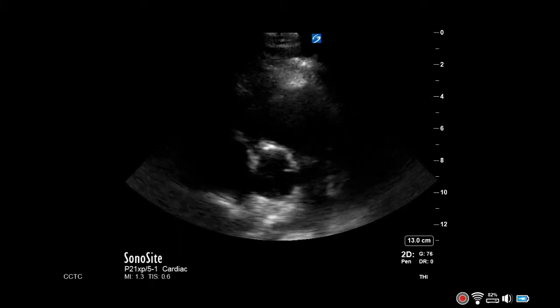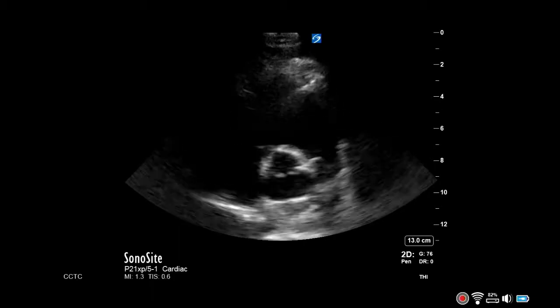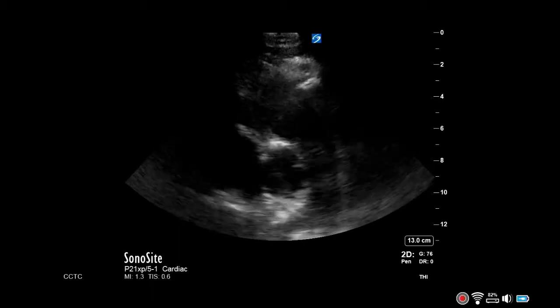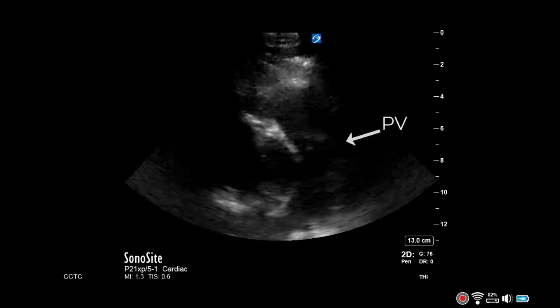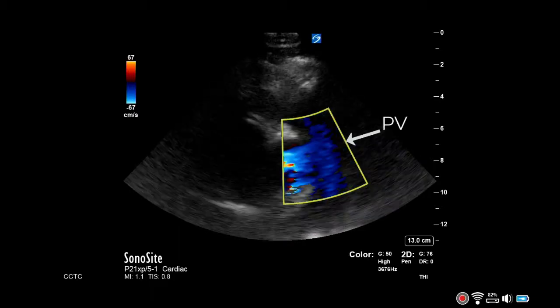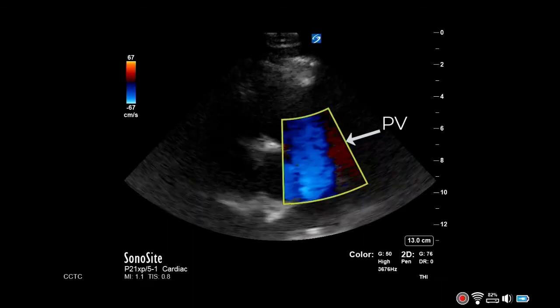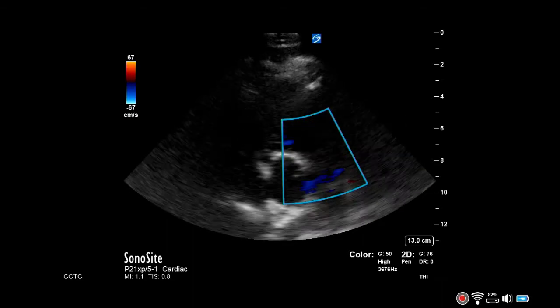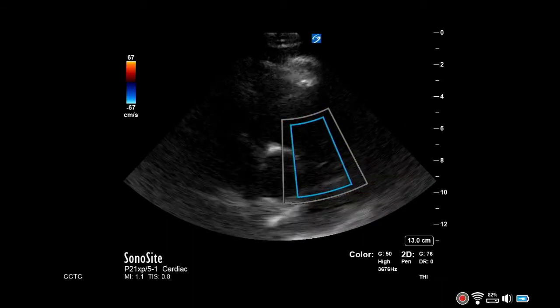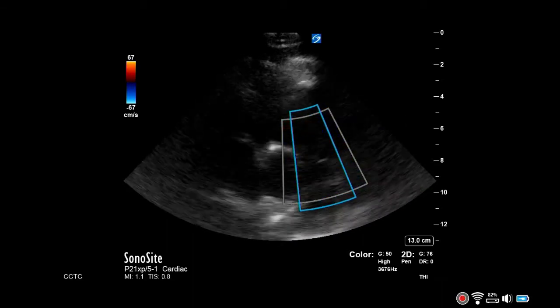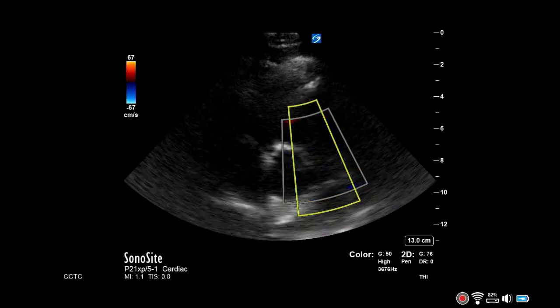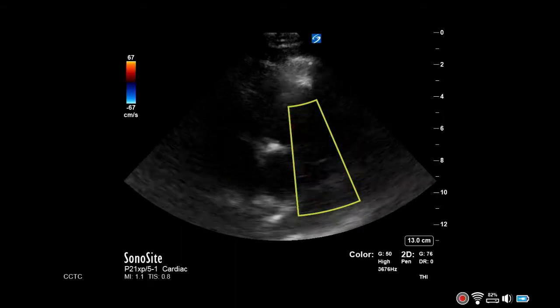Begin in the parasternal short axis at the level of the aortic valve with the pulmonic valve visualized. Enable color Doppler and place the box over the pulmonic valve, extending to cover the RVOT.